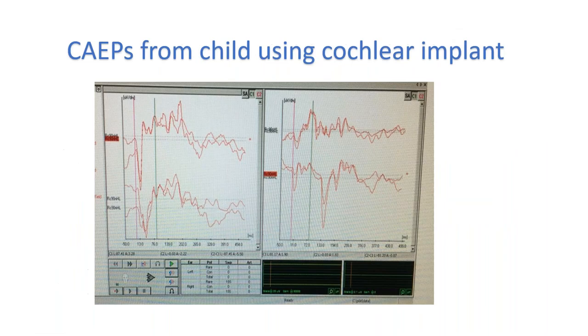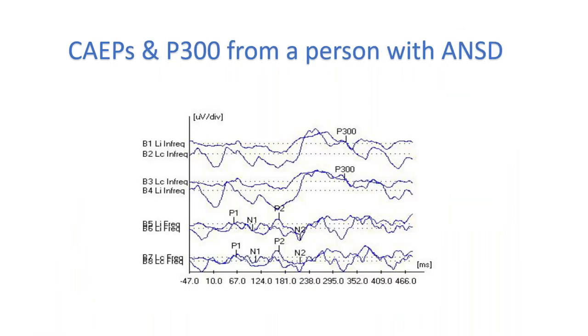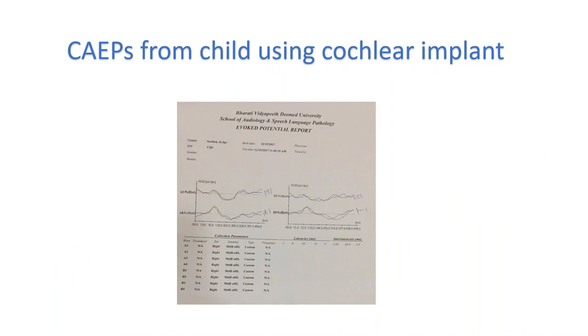Or I have a question, Vanaja. How do you differentiate an ocular potential from a muscular potential? Because I think when you're trying to take off those artifacts, you would check which one it is, and then try to eliminate it, I presume.